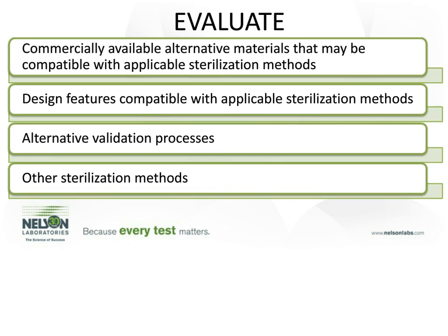And then also design features that are compatible with the applicable sterilization methods, such as those that I just mentioned. And, of course, with combination products coming up and the sensitivity of some of these materials, there might be alternative validation processes that might be more appropriate for something that might not be able to handle some of these terminal sterilization processes. And then, of course, other sterilization methods, which will be discussed in a little bit more detail by Martel.